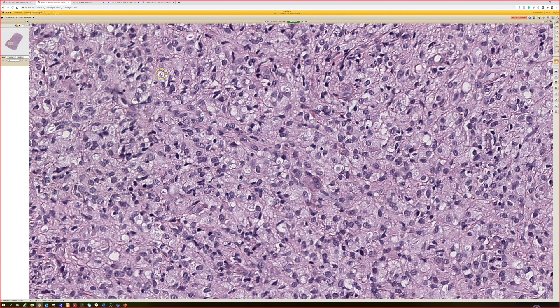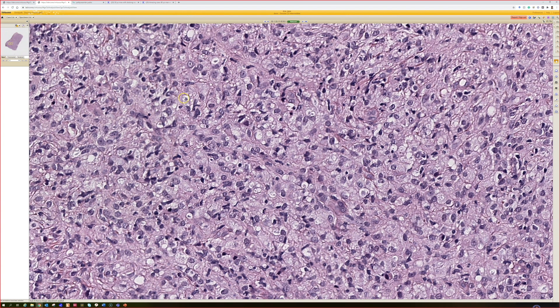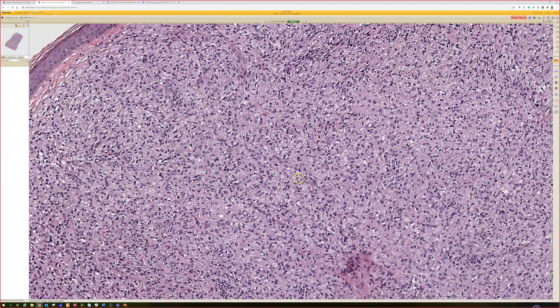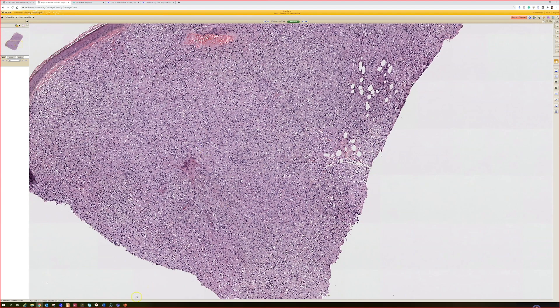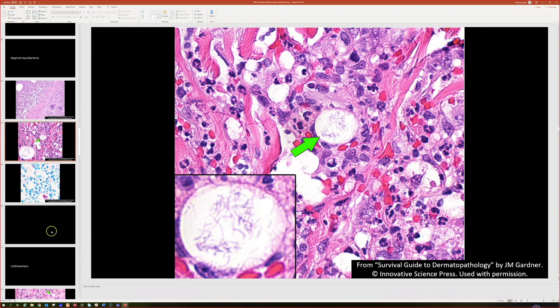They have those little empty holes or spaces — vacuoles — filled with mycobacterium leprae organisms. This pattern is very distinct for leprosy, particularly the lepromatous form. You could even argue this one might classify as histoid leprosy, which is when it basically becomes like a fibro-histiocytic pseudotumoral response to leprosy.